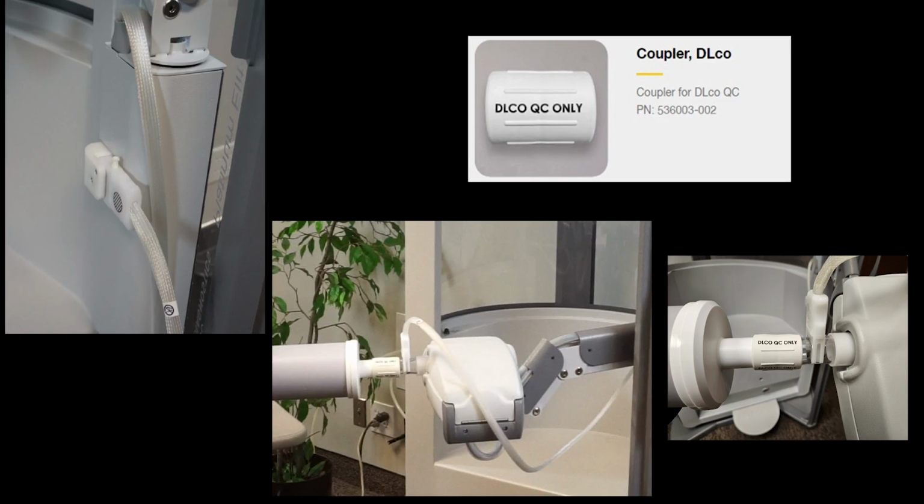DLCO quality control should be performed weekly per the ATS guidelines. This test is performed with the BTPS correction turned off. This means you can add DLCO testing to the same patient visit that was used for syringe spirometry testing. Prior to each DLCO effort, place the umbilical clip into the calibration port and perform a DLCO gas calibration. Once the gas calibration has passed, connect the umbilical clip to the pre-vent flow sensor and have the syringe and flow sensor connected to the head of the system.